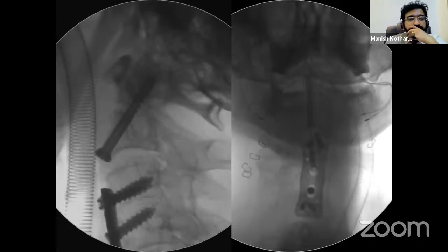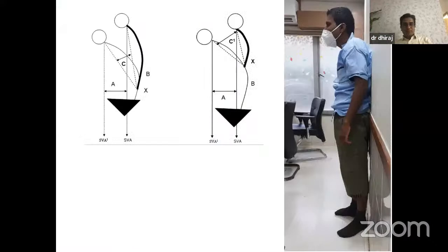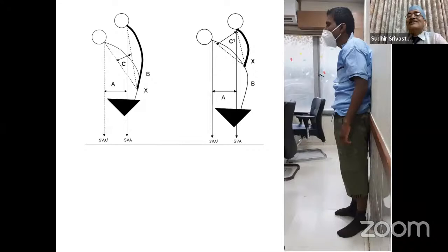Very well done. Excellent work, sir. Good. Thank you. This fracture is in good alignment of the sagittal spine. So, I think this fracture has led to a deformity correction also. Partly, sir. Just 9 degrees, not much.